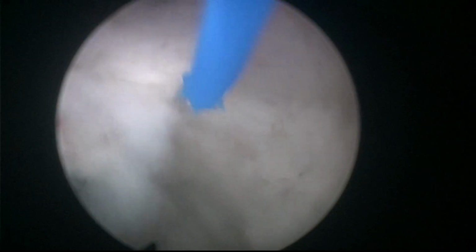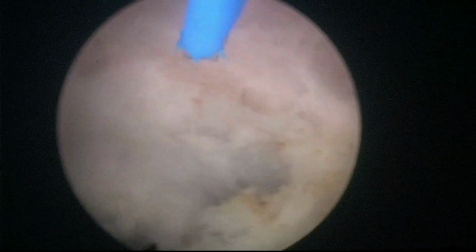You see, many surgeons try to leave a little bit of tissue very close anteriorly at 12 o'clock near the apex, because probably it respects the sphincter even more. But there we are. Also, the improved cutting properties of this holmium make this trimming exercise much easier.